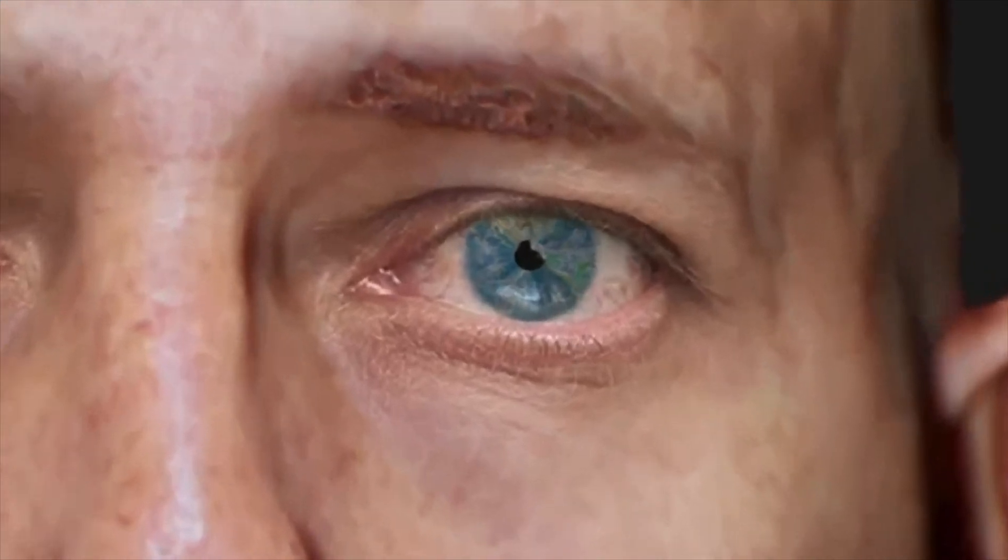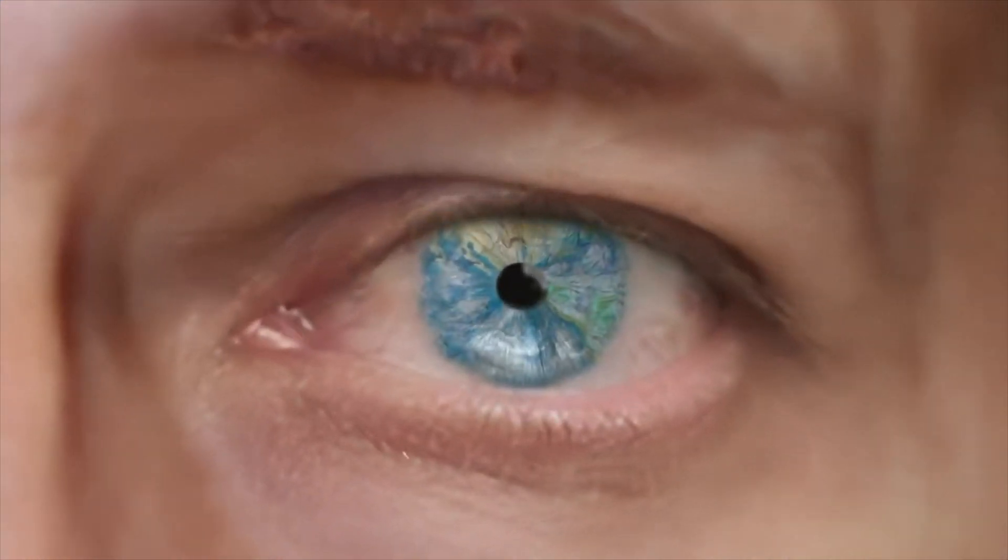In order to avoid eyeglasses in all situations and at all distances, replacing the eye's lens with an artificial intraocular implant is the best way to go.